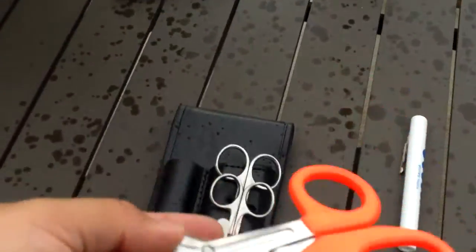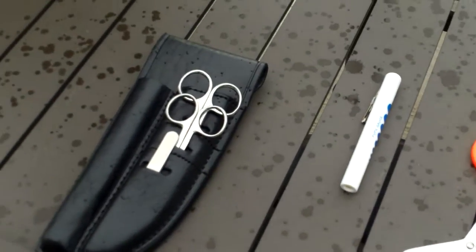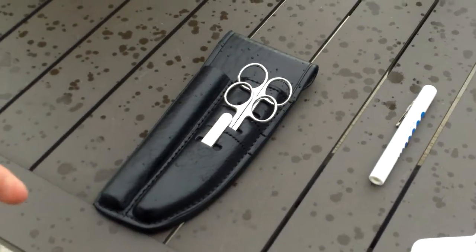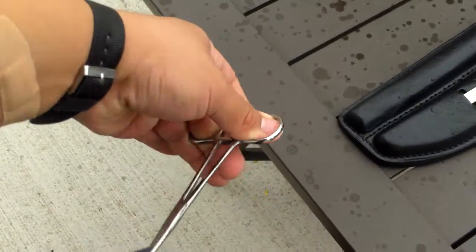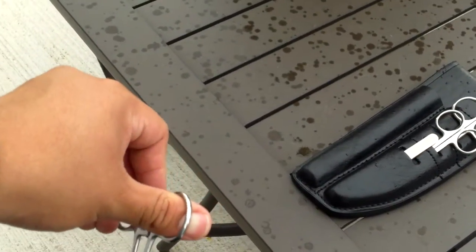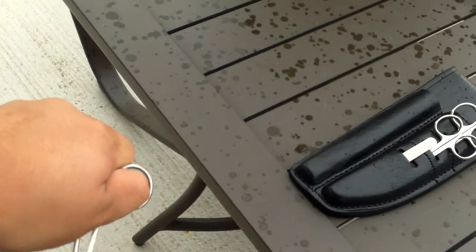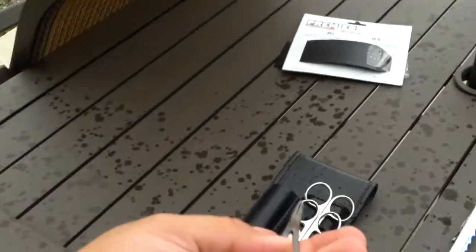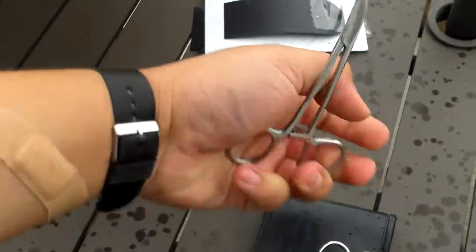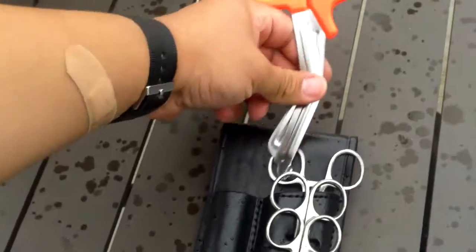Trauma shears — you're definitely going to use them. The clamps, we all carried them because they had their purpose, but pre-hospital care I can't say I've ever used them. I just never had a situation that called for them, but it's nice that they include that.